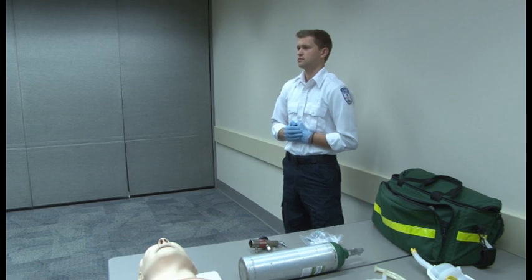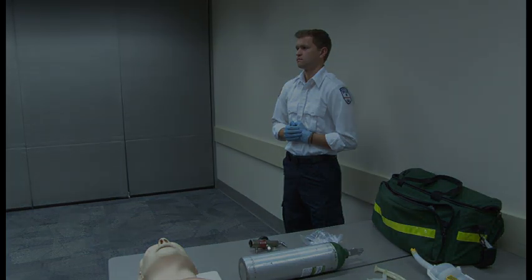No questions. Alright. At this time, please take two minutes to check your equipment and prepare whatever you feel is necessary. I'm prepared.